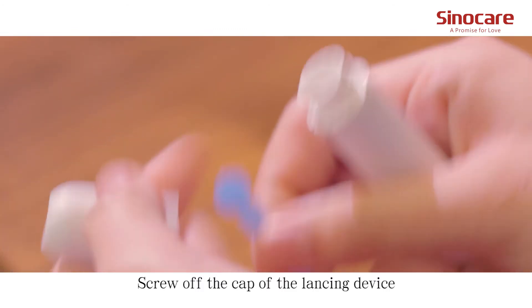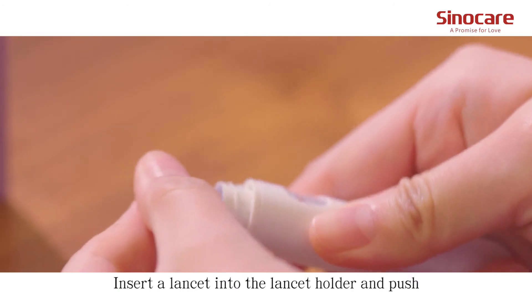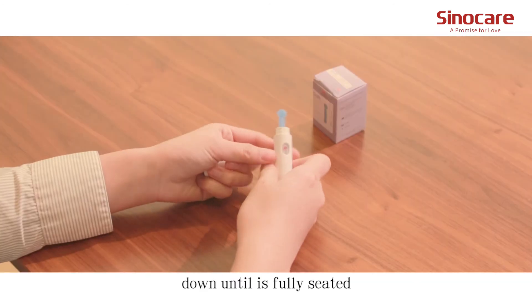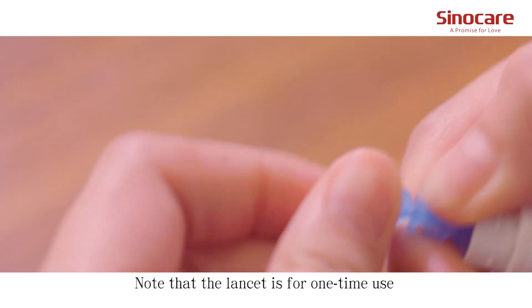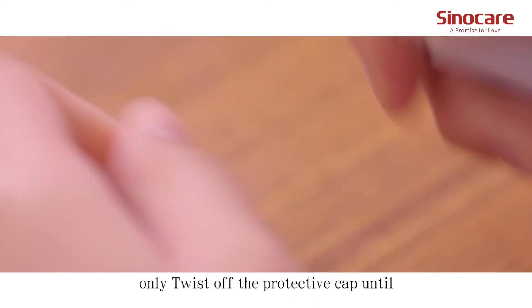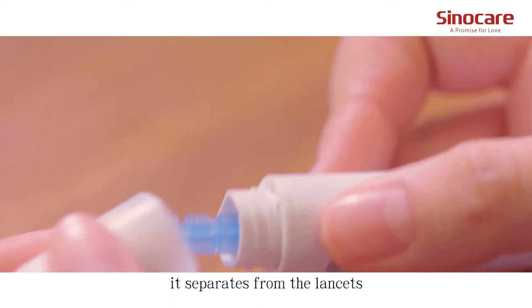Screw off the cap of the lancing device. Insert a lancet into the lancet holder and push down until it's fully seated. Note that the lancet is for one-time use only. Twist off the protective cap until it separates from the lancet.